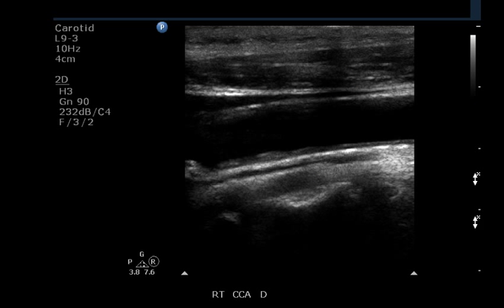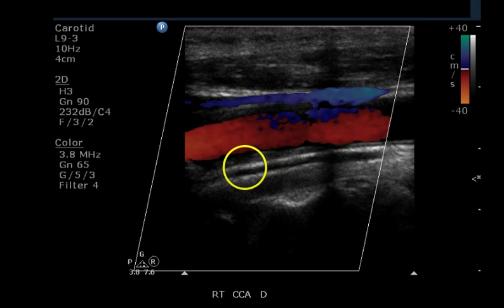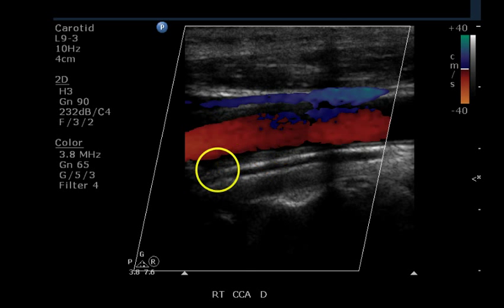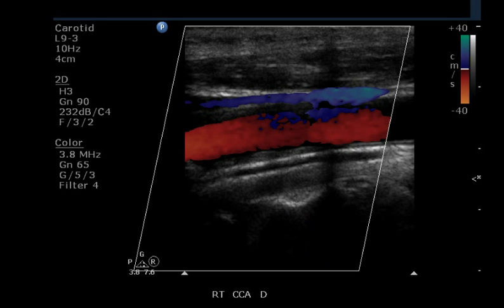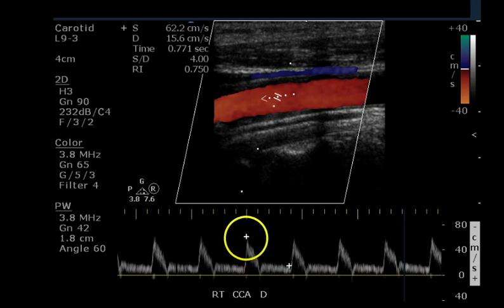This is grayscale imaging of the distal common carotid artery, and it does appear that there is a small amount of intimal thickening. Color Doppler confirms that — we can see the flow does not go all the way to the outer wall, but just to this thickened intima in both the far field and near field. Pulse Doppler shows a perfectly normal signal with a beautiful waveform, nice spectral window, very sharp straight upstroke, and a nice dicrotic notch.